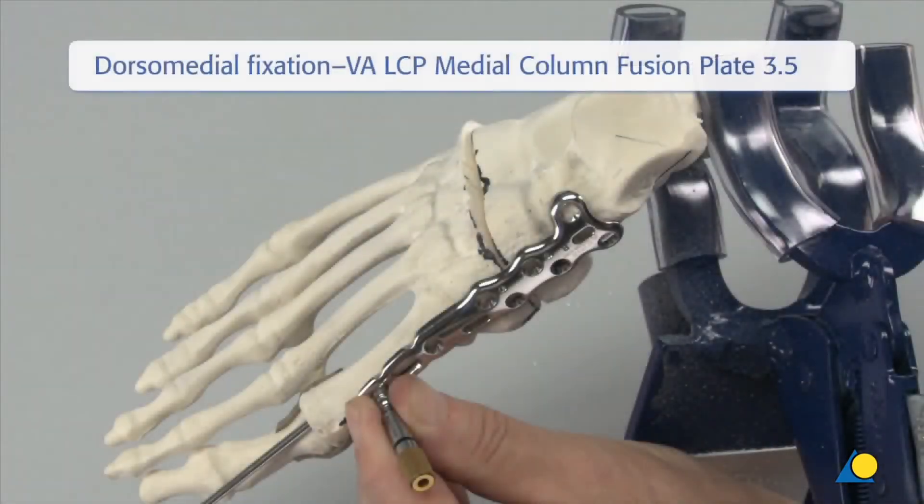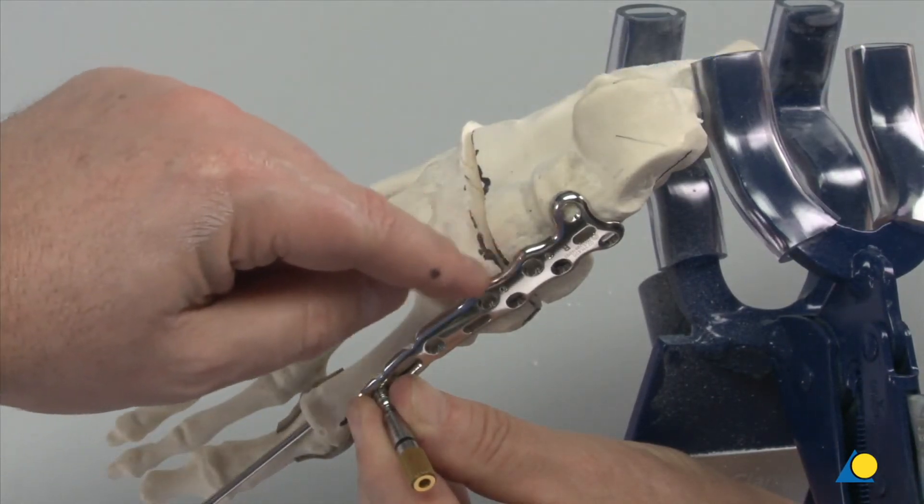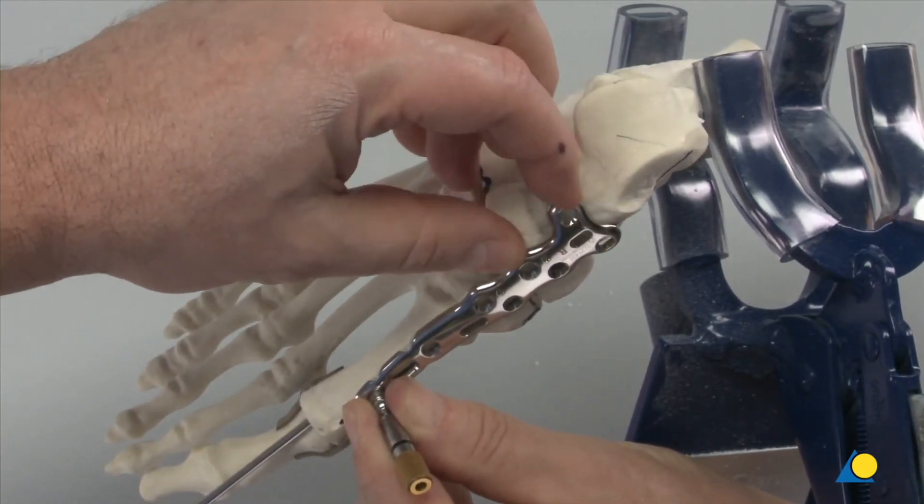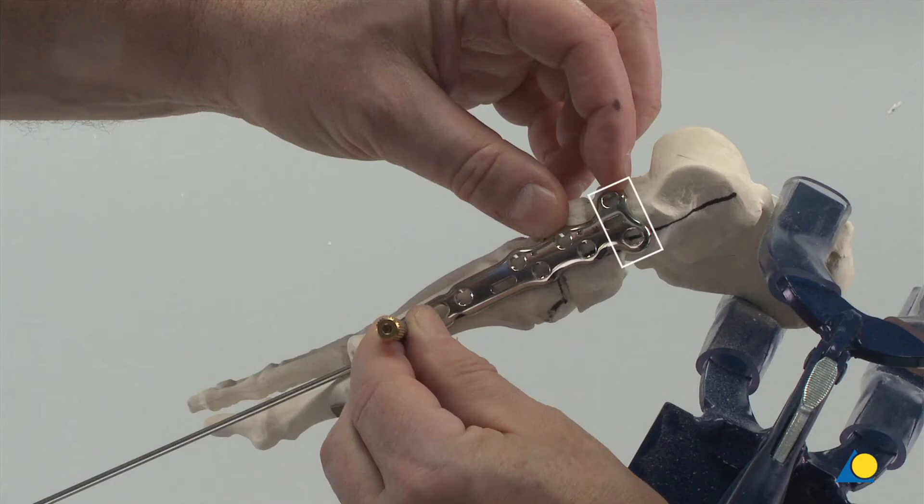The compression-distraction rod is inserted into the threaded hole at the distal end of the plate. The plate is positioned dorsomedially so as to span all the joints of the medial column and allow for two screws to be inserted in the talus, navicular, and cuneiform respectively, with the remaining screws in the first metatarsal.